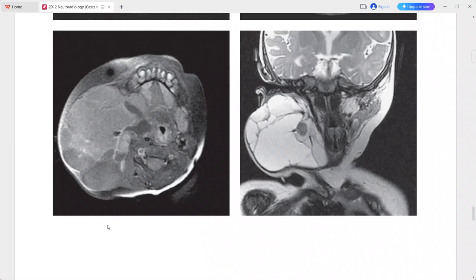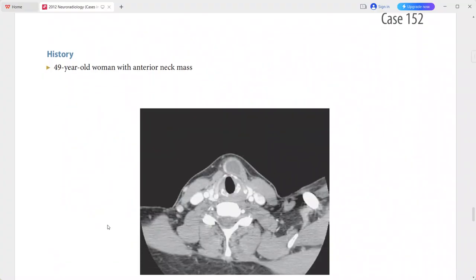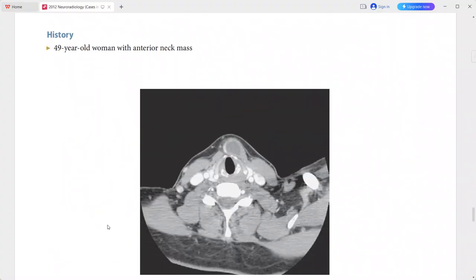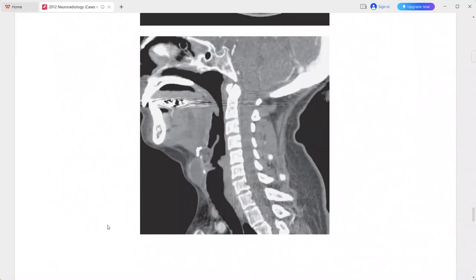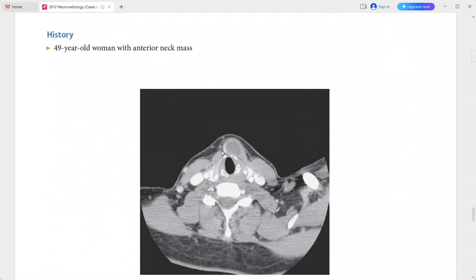Next is a 49-year-old woman presenting with an anterior neck mass. There is a well-defined low attenuation anterior neck mass deep to the strap muscles, abutting both the hyoid and the left thyroid lamina. There is a small focus of higher attenuation material along the right side of the lesion representing ectopic thyroid tissue.